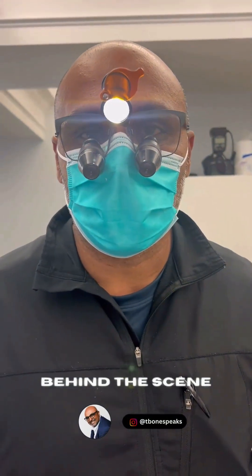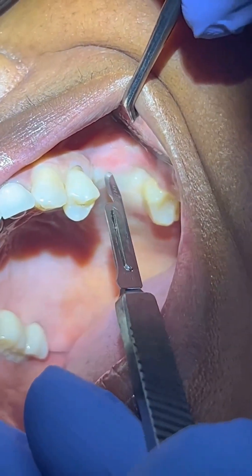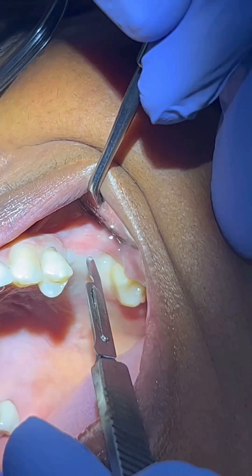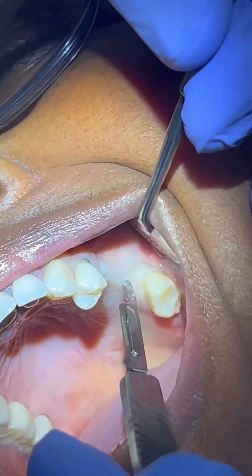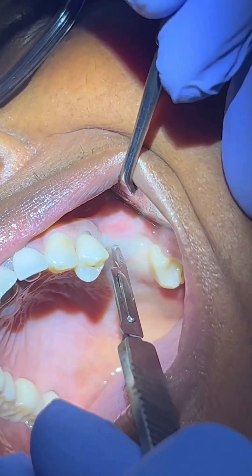We have a couple of implants that we placed and we're going to do an uncovering. As you can see here, we did cover screws only, no healing abutment, so we have to do an uncovery and restoration delivery. You see that we have the non-keratinized tissue come up like this. We don't want to do tissue punches — we want to do a reflection maintaining at least two to three millimeters of keratinized tissue.